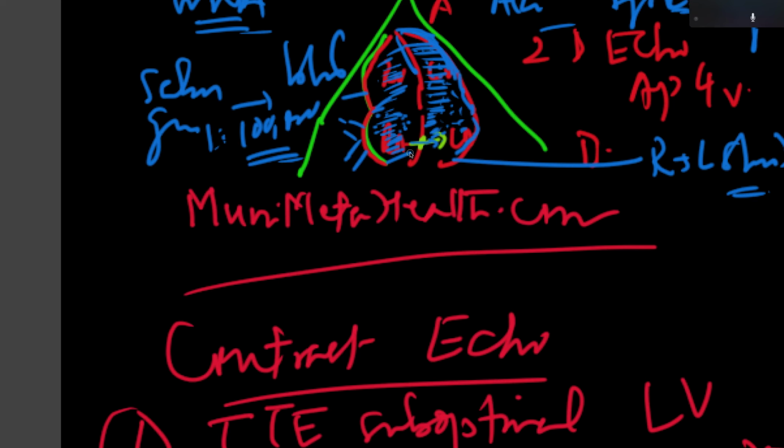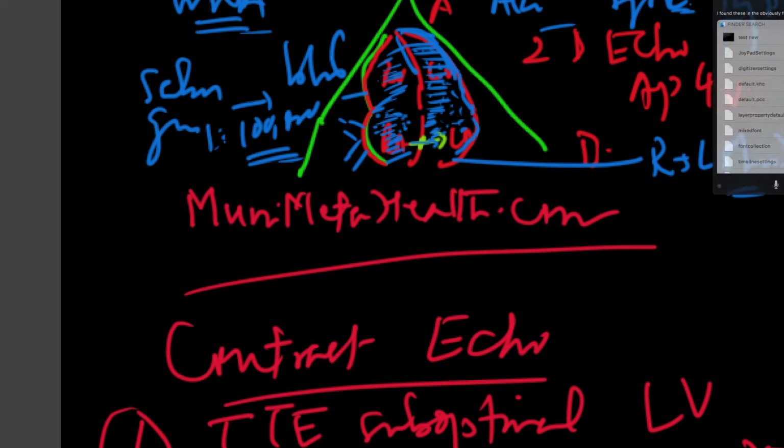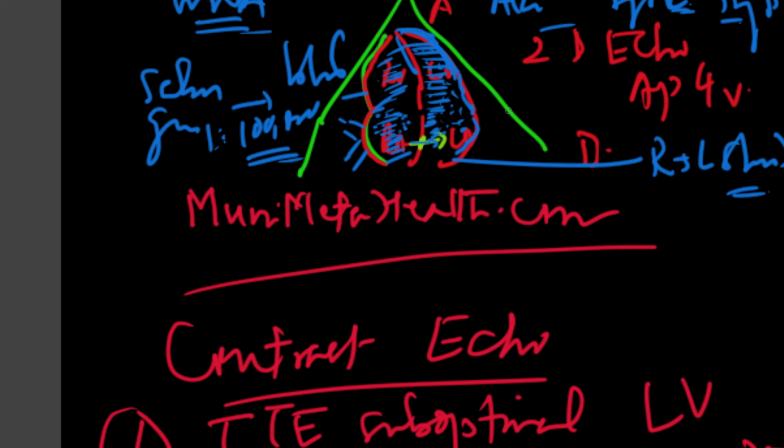The principal use is utilizing air bubbles produced by the agitation of saline in the recognition of intracardiac shunting. And so particularly, PFO is the clinical entity being interrogated. And with contrast agents, you can combine that with harmonic imaging, and we'll talk about that in a different setting. And left ventricular opacification, specifically if you wanted to see the wall motion abnormalities.